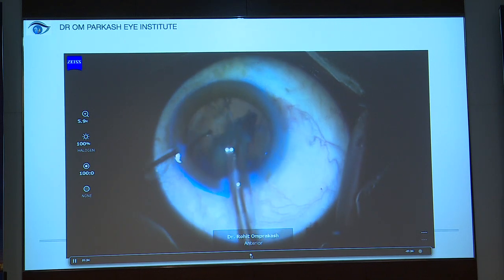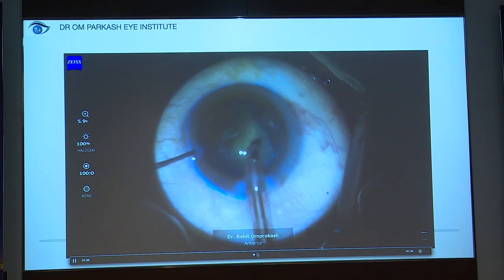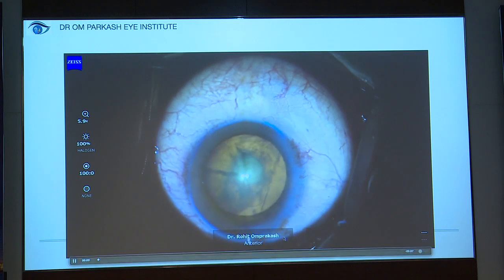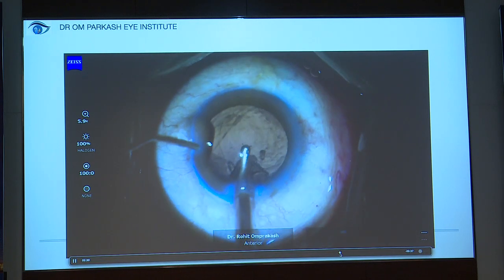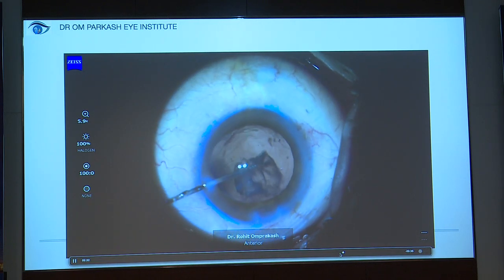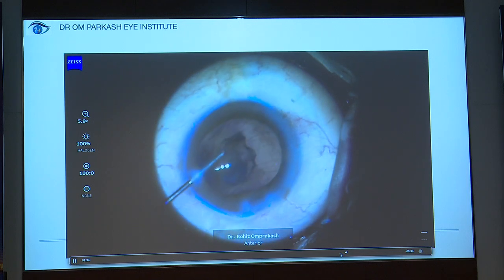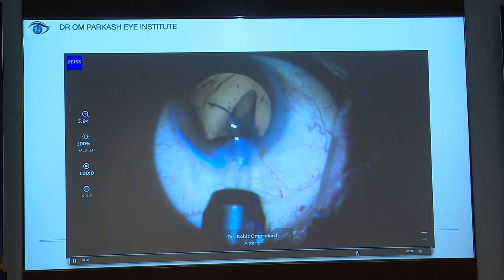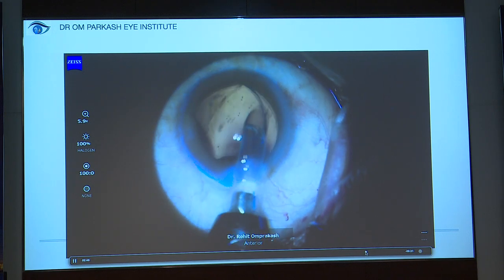Now the last nuclear fragment or the epinuclear fragment is coming out. Sorry. So once that is done, so here it is. Now I'm doing dry irrigation, dry aspiration, and the IOL will get into place, a multi-piece IOL.